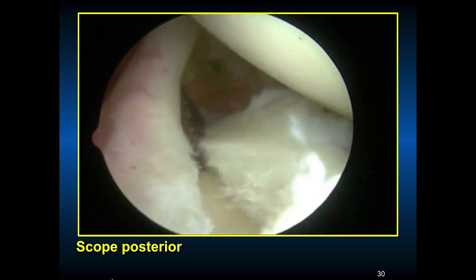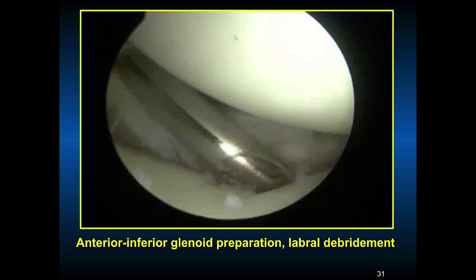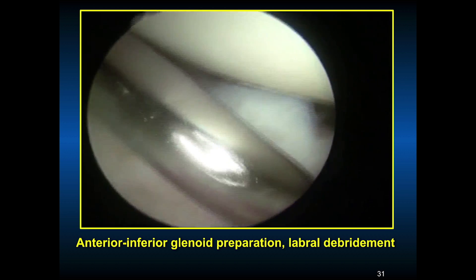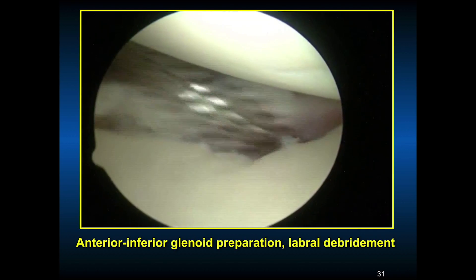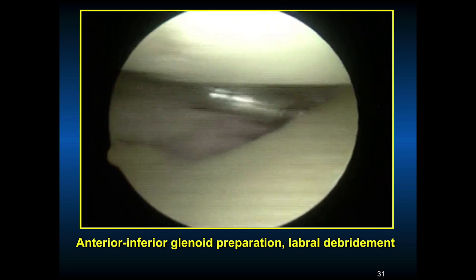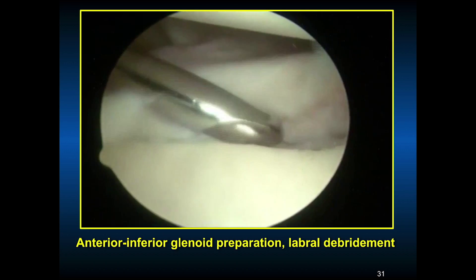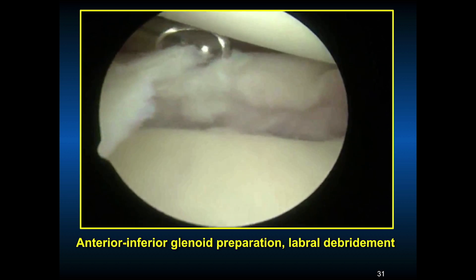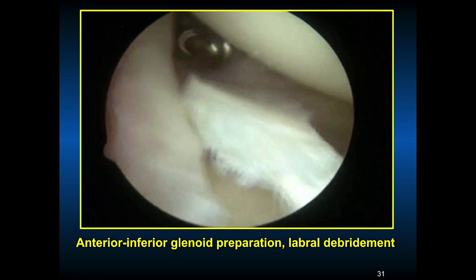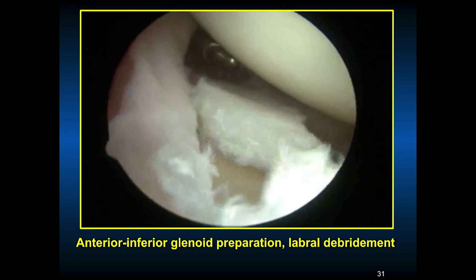We still have the anterior inferior instability in the front. It is important to prepare the glenoid to get a good bleeding base. In chronic anterior instability, there is often a lot of fibrous tissue and you may find a bony Bankart. You have to strip the tissue anterior inferior so you can re-attach it to reestablish the normal lip of that golf tee anteriorly.